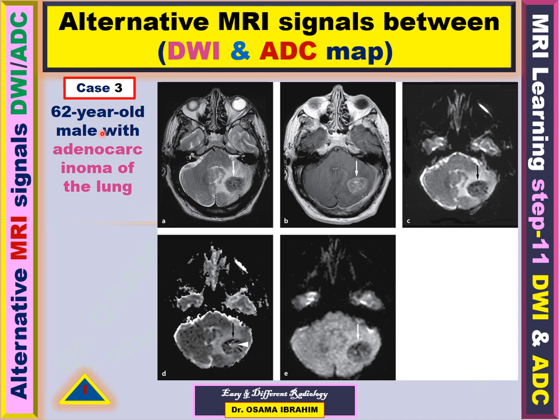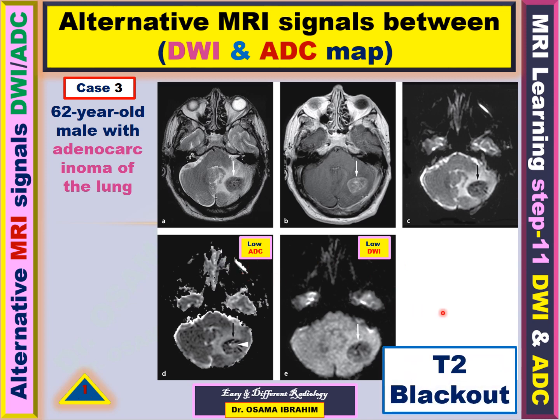This case is a 62-year-old male with a history of adenocarcinoma in the lung, with lesions present on imaging. This is the diffusion-weighted image — the lesions appeared low signal in diffusion. This is the ADC — the lesions also appeared low signal in ADC. Low signal in both — so what is the MRI scientific expression? It is T2 blackout.